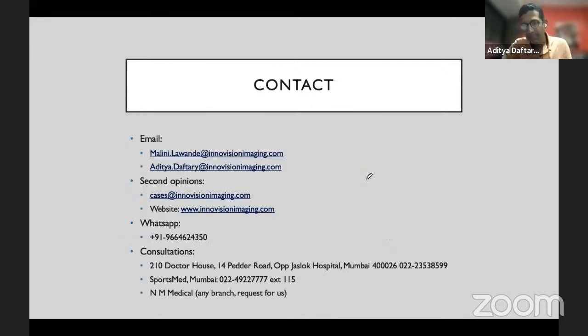So with that, I'll just stop, in terms of giving you a sense of what I've tried to do is give you some idea of what structures look like, where they are. And I thought maybe it's better for us to open this up to questions, which would help us to direct this talk in a better way.